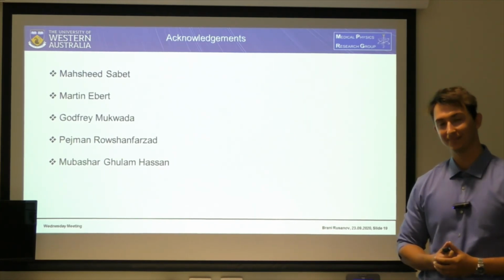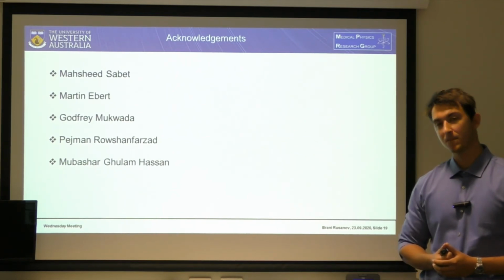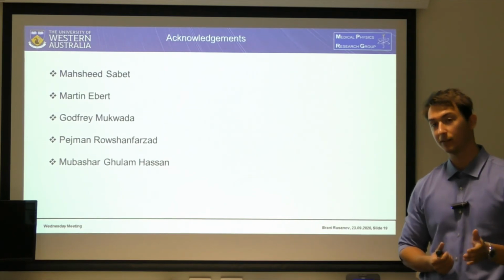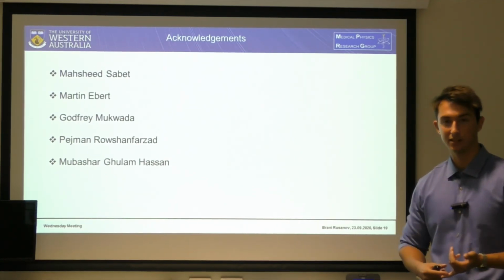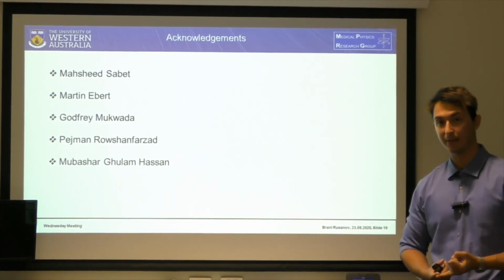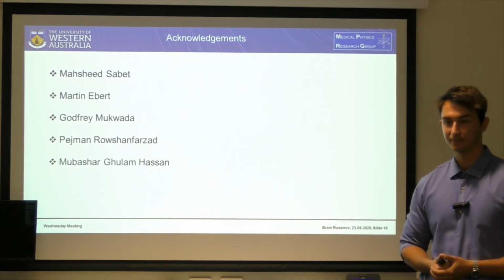Did you investigate how robust the model is on different CBCT modes, or would you have to train a new model for every one? You would have to. If you change any scanning parameters, you have to retrain it, unfortunately, because there are different scatter conditions and different absorption physics happening. Thanks, really nice work. Thank you.